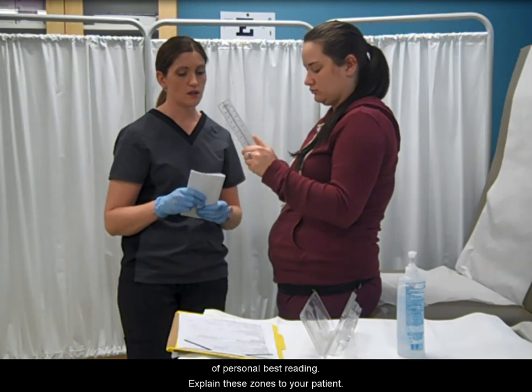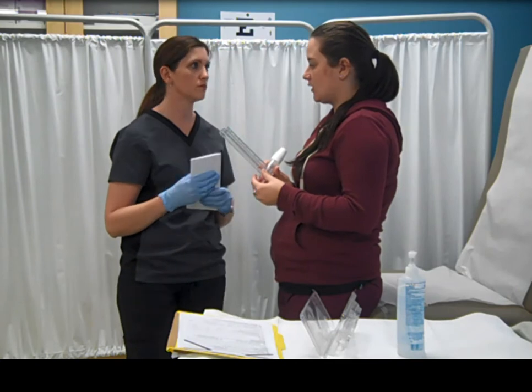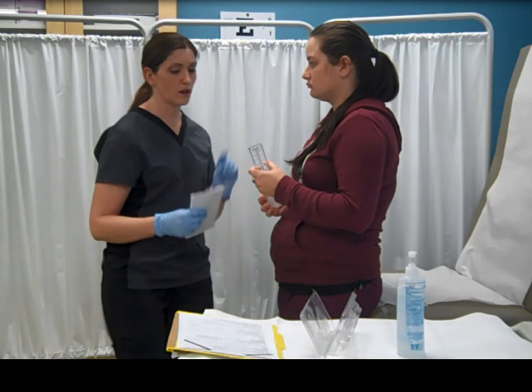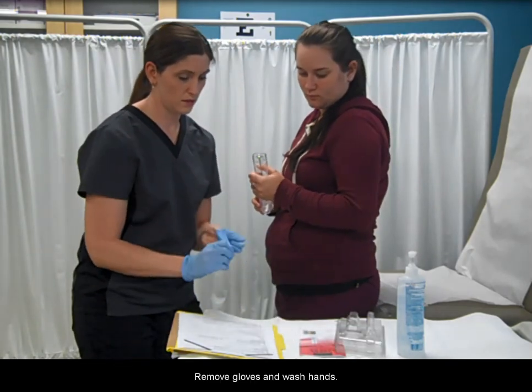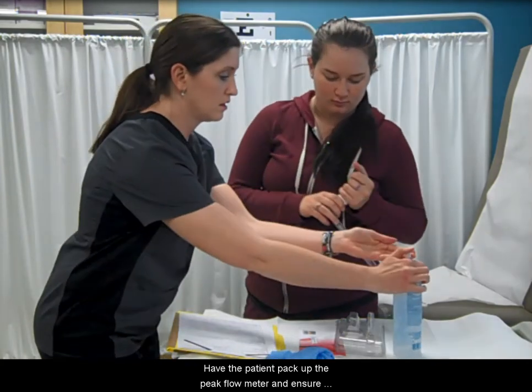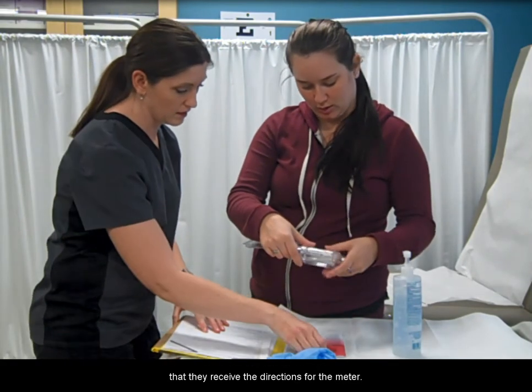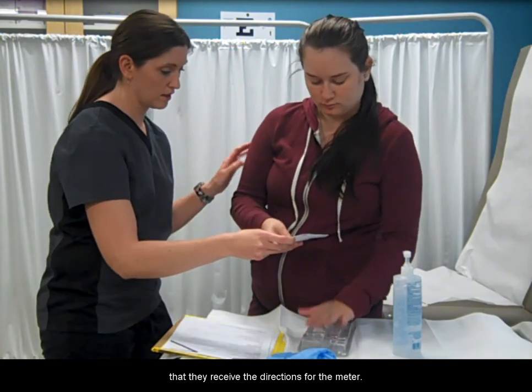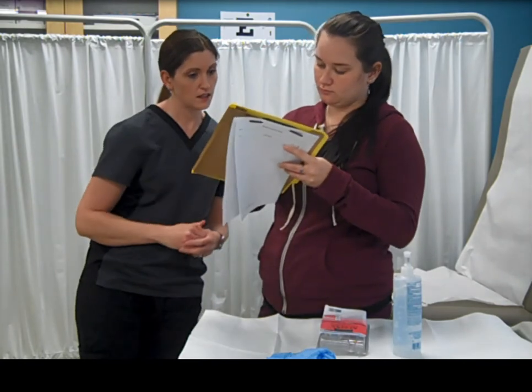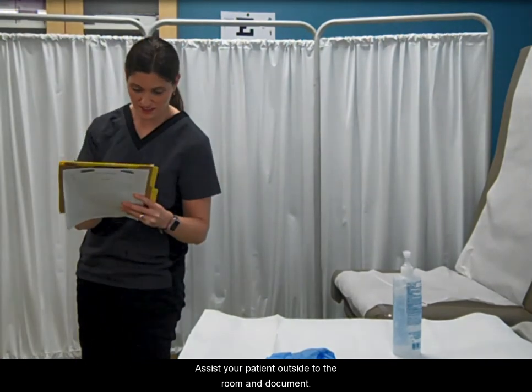Explain these zones to your patient. Remove gloves and wash hands. Have the patient pack up the peak flow meter and ensure that they receive the directions for the meter. Assist your patient outside of the room and document.